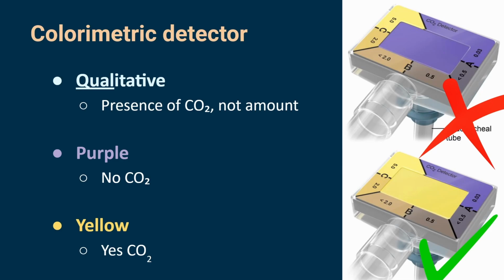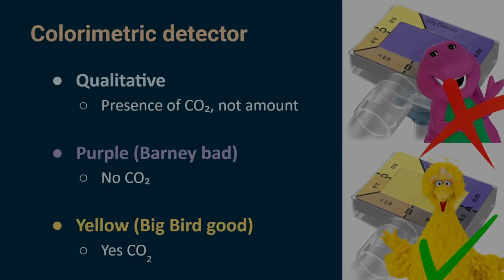Yeah, absolutely. What sucks is you've got a time that you need it, and then you pull it out, and it's already the wrong color. You're like, oh, well, great. Oh, no. Just breathe across it. So colorimetric devices, much like those dead space bulbs, are largely just saying, is something present, yes or no? That's a qualitative effect.